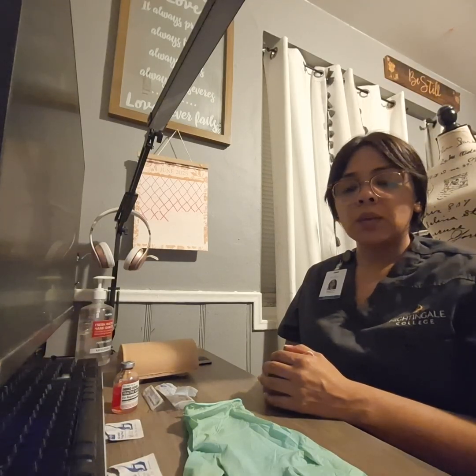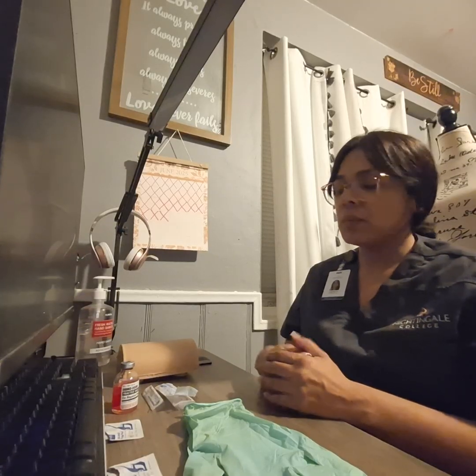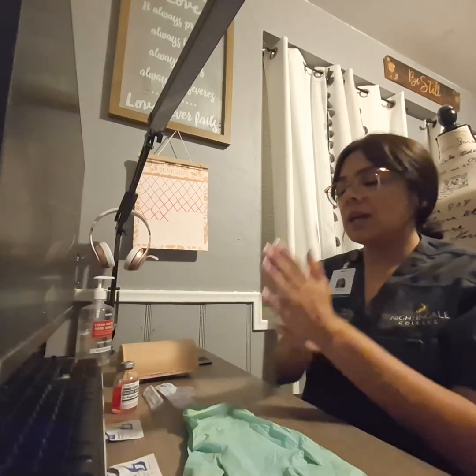I will enter the patient's room. I will close the door behind me to ensure patient privacy. I will perform hand hygiene.